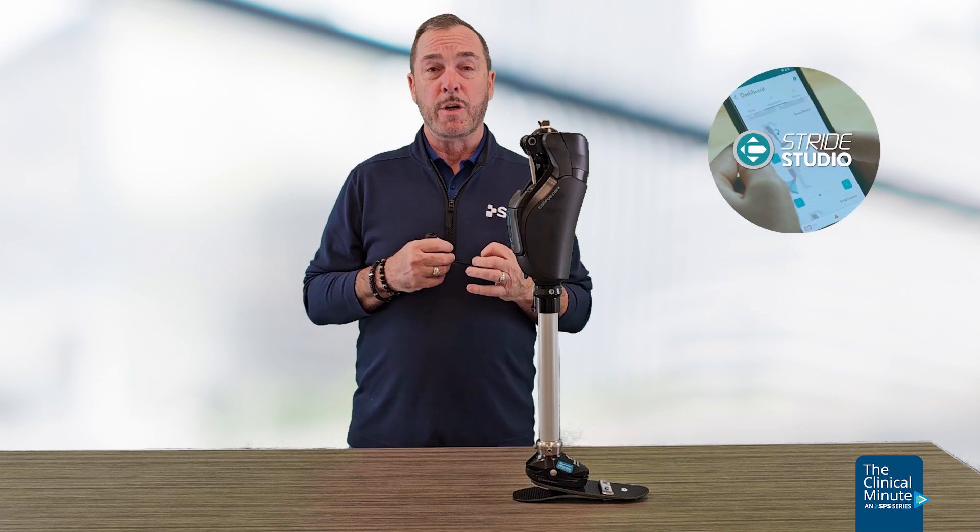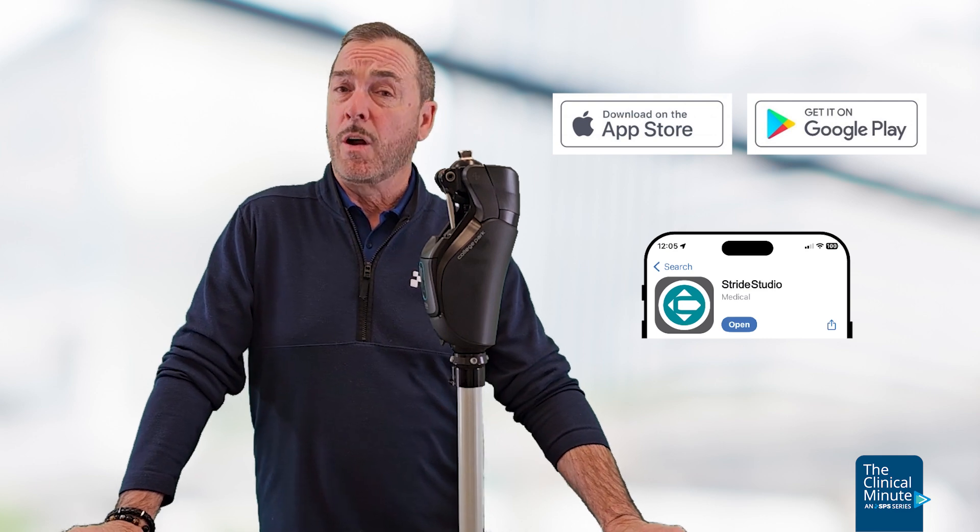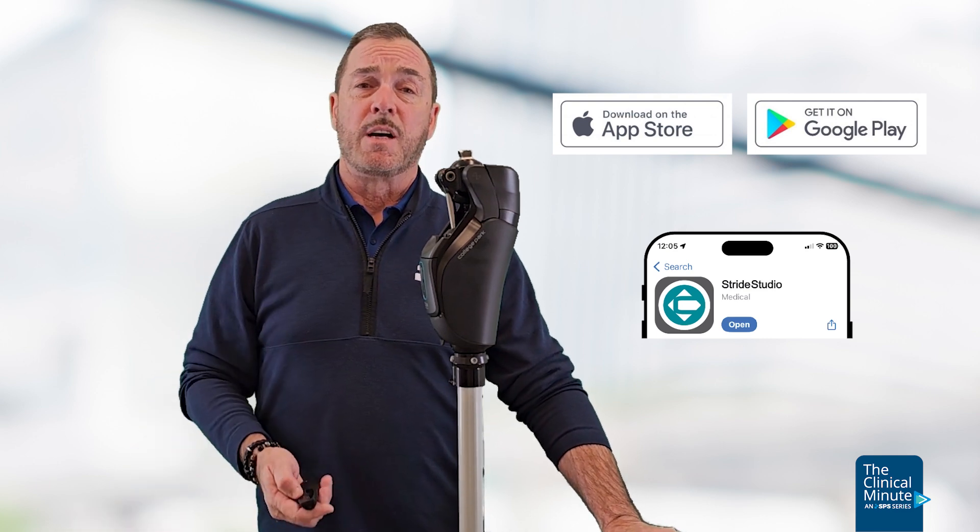The Icon Microprocessor Knee is an inherent stance control knee with hydraulic dampening and a microprocessor. It pairs with either your iOS or your Android device through the Stride Studio app — available for both the clinician and the user on Android or iOS devices.